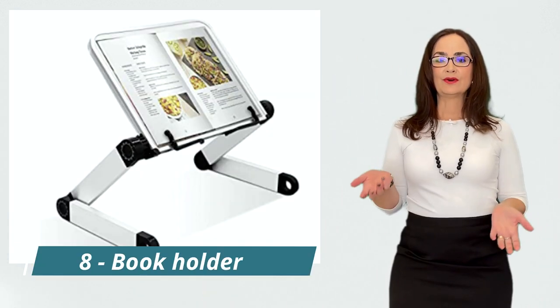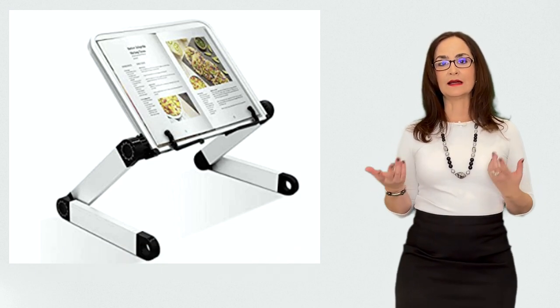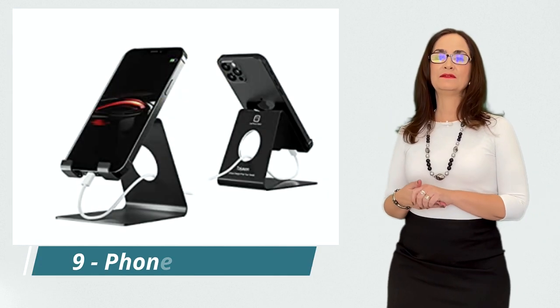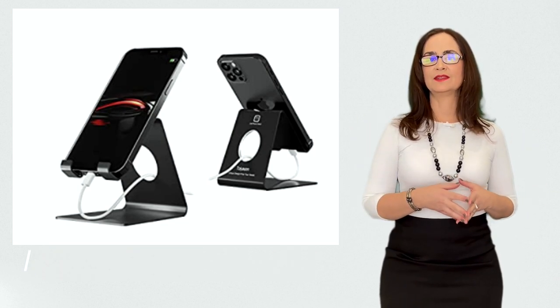This is a book holder. These are great devices to hold a book, a tablet, or a recipe book. They can be used in the office, the kitchen, or in your bedroom. This is a phone holder — similar to the book holder, but this one is for your telephone. You may get one for your home and one for your car.